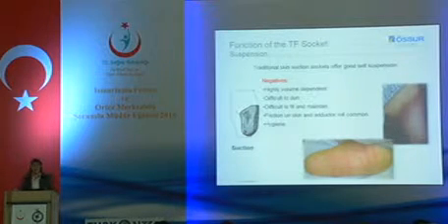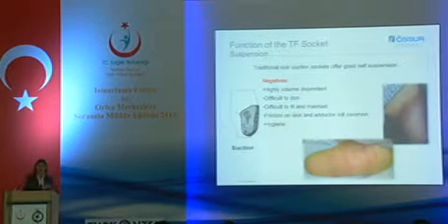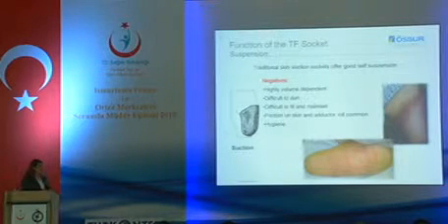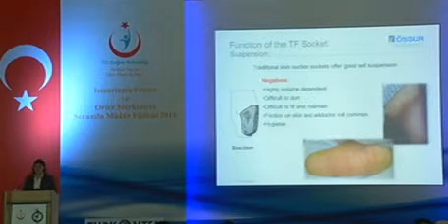And of course it's a hygiene thing, so skin against thermoplastics or laminate material is not always the nicest, because it's very difficult to clean and to prevent any infections. If you have any slight wounds in the residual limb, it's not always so nice.